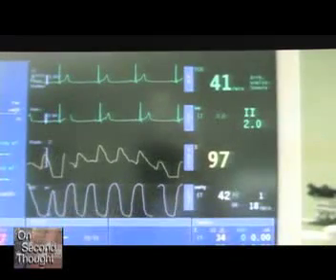In this particular patient, young, athletic, the heart rate is only 41. Oxygen saturation is 97%. That means the patient's blood is pretty much completely saturated with oxygen, as much as it can carry. End-tidal carbon dioxide here is 42. The normal number is about 40, 42. So that's what you expect to see in a patient who is breathing regularly. That would be the end-tidal carbon dioxide for any of you. In fact, for those of you sitting here, that's about what you would see right now for yourself. Most of you would have a heart rate that is probably closer to 70 to 80. Please continue.